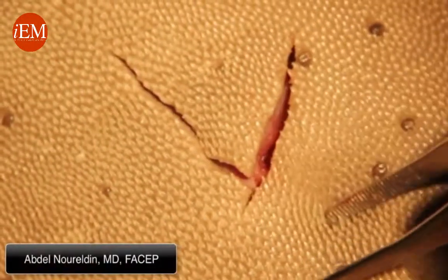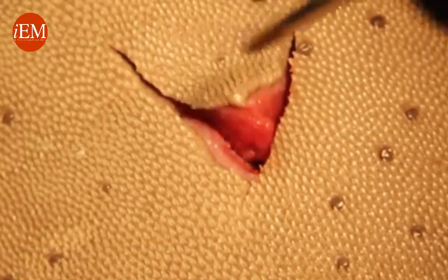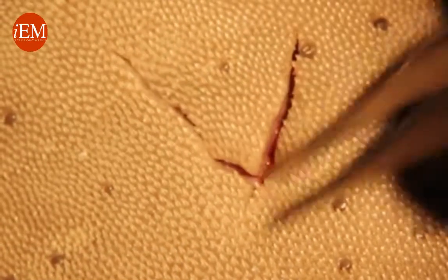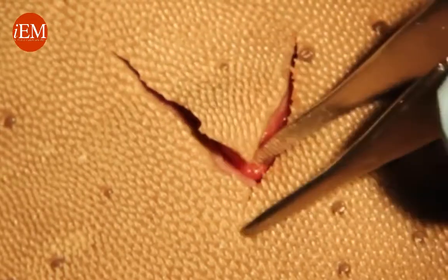Now we're going to show you how to put in a corner stitch. You see this is a corner — a triangle laceration that we're going to need to put a stitch through the corner. We start from the top.